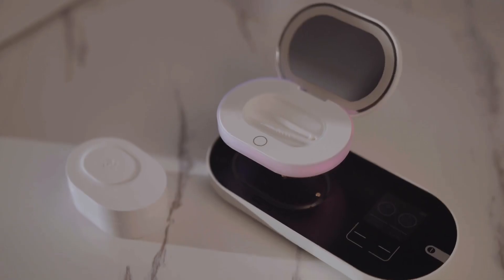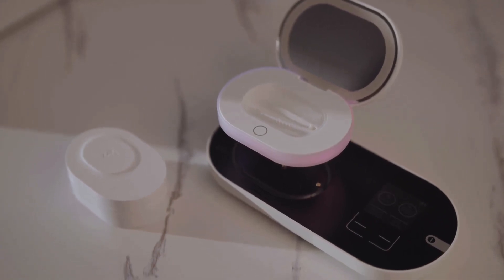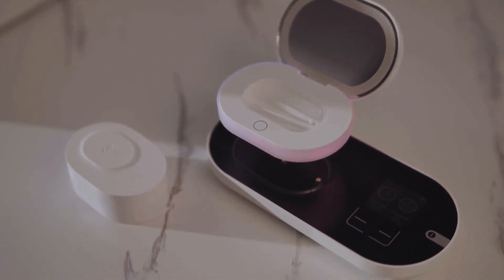With 9 years of research and development, 5 generations of products, and countless real user reviews, ReO2 Generation 6 is the most potent contact lens cleaner we've ever made. Your support will enable us to start production and bring this wonderful product to people like you. Thank you for backing our project.